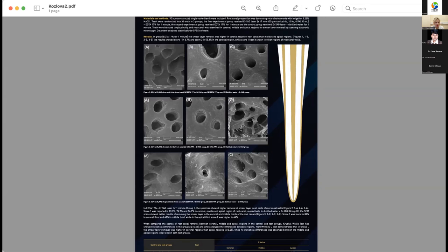Our protocol is photon-initiated photoacoustic streaming, with tips made by the Fotona company, which is applied using a large and short tip with low energy on the access cavity of the root canal. Then collapse of the intracanal irrigant follows, with hydrodynamic pressure.